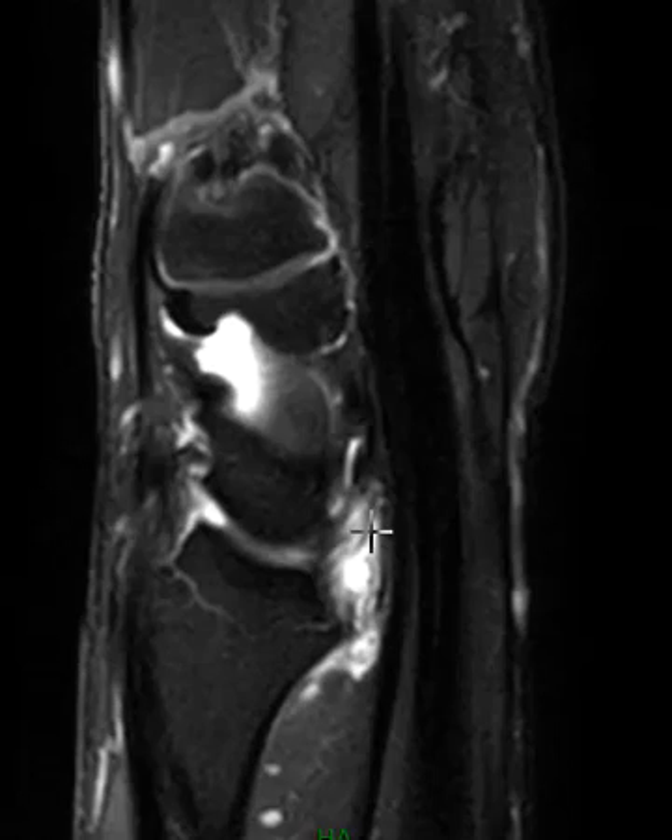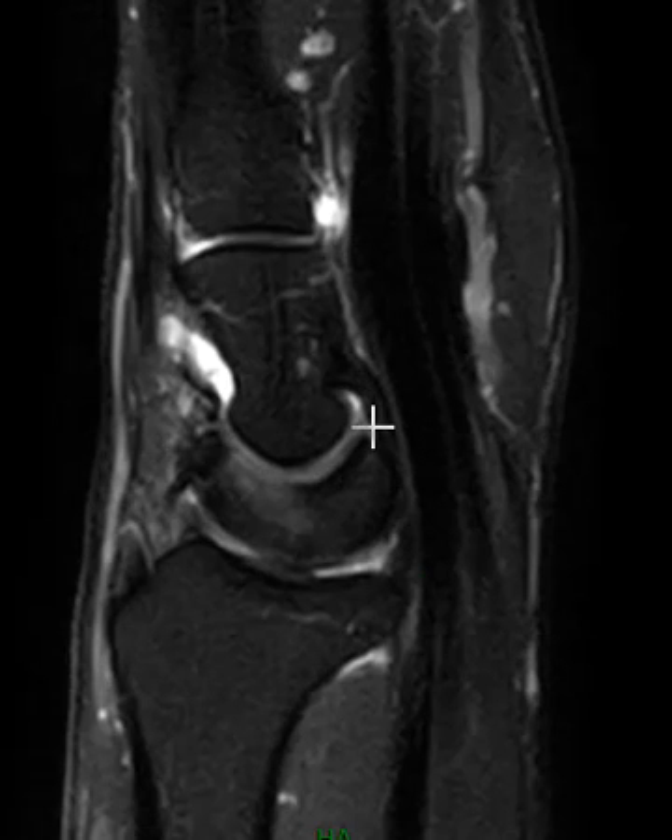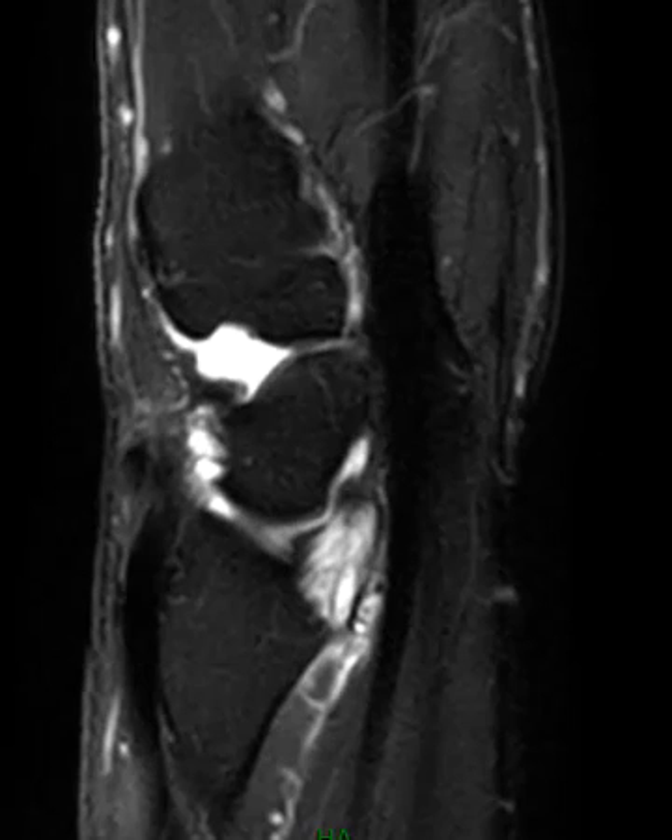This whole thing right here is a partially torn, edematous radioscafocapitate ligament, and then it becomes normal here more towards the central part of the wrist. Thank you very much!